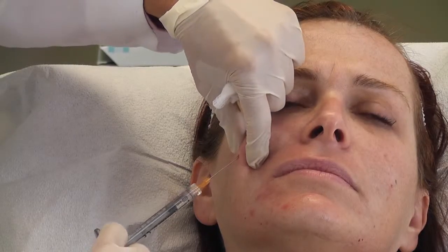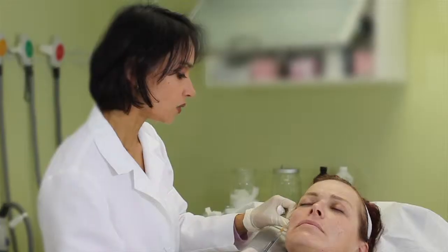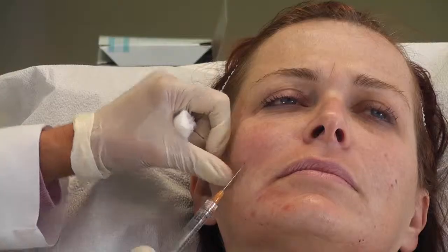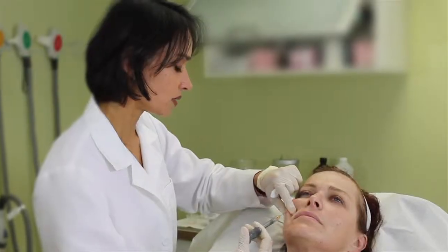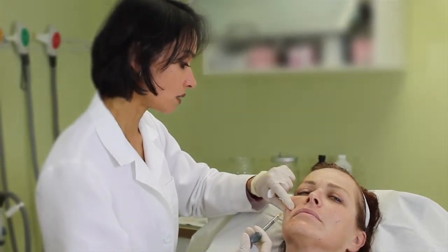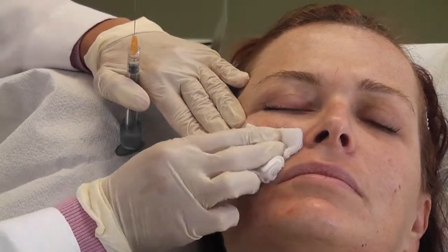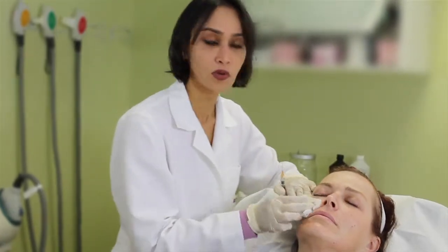As we are injecting fillers deeper and deeper, and we are increasing the likelihood of injecting into big arteries and cutting through vessels, I certainly feel like the cannulas offer me a margin of safety that a traditional sharp needle did not. If you're not cutting through blood vessels as a sharp needle would do, we obviously don't get any bleeding under the skin, and therefore no bruising.